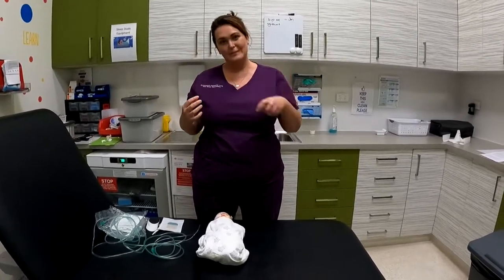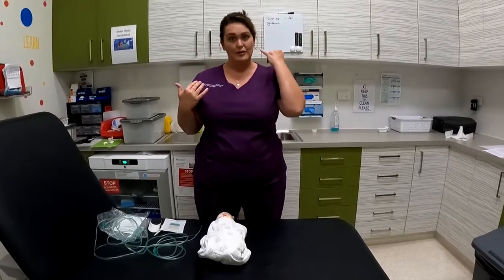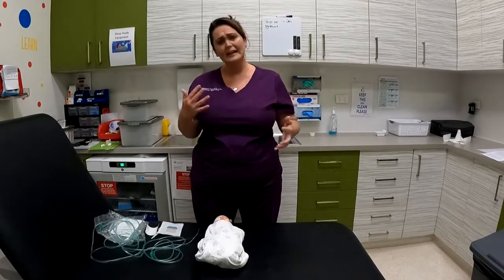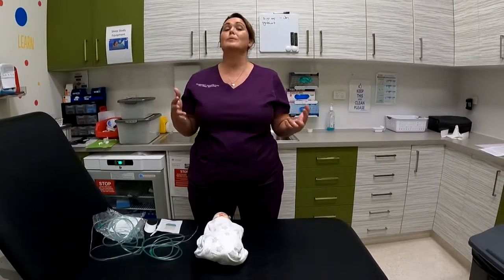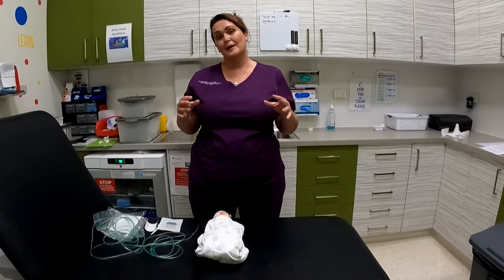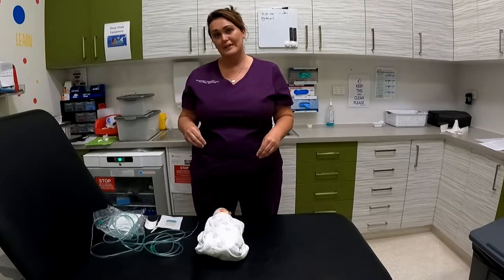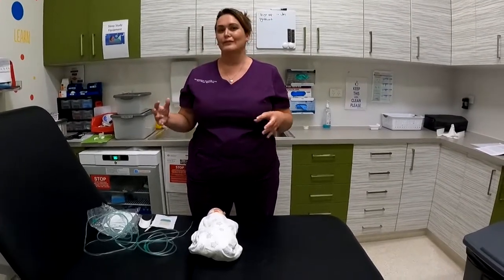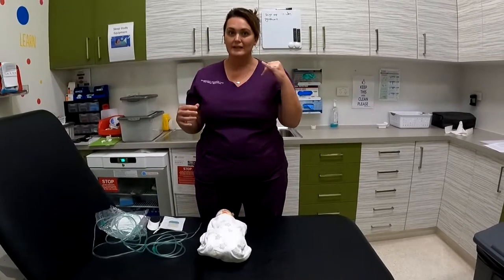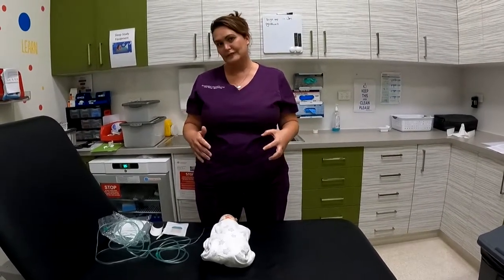It's important to keep that nice and loose so that they can swallow their secretions down and keep their nose really clear. If you're finding, for example, that you go to feed your baby and they pull away and fuss about a bit, it might be that their nose is a little bit blocked. So it can be really beneficial to give them a little spray up each nostril before feeding, just to make sure everything's clear. Like I said, don't be afraid to use the saline spray.